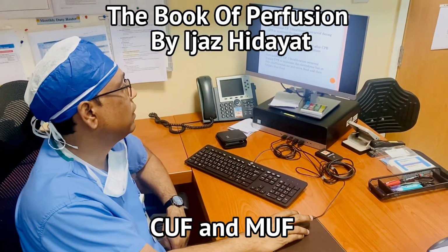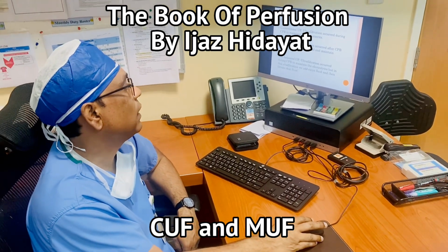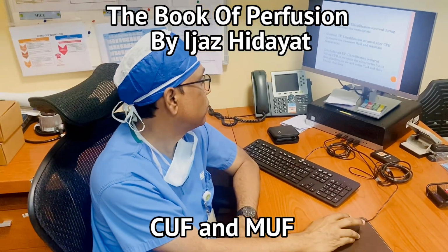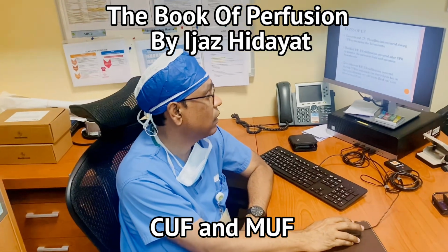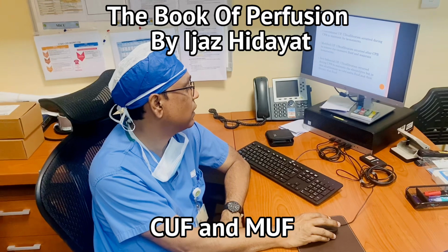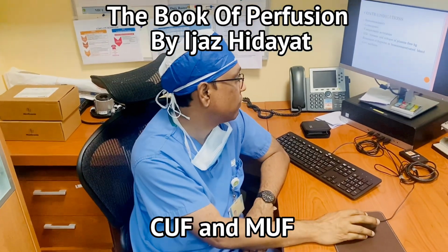But modified ultrafiltration occurs after the bypass to remove excess fluid and maintain the hematocrit. Zero balance ultrafiltration occurs during the bypass to maintain the electrolytes, but in this ultrafiltration we add extra fluid and then the filtrate taken out is equal to the fluid which we have given.